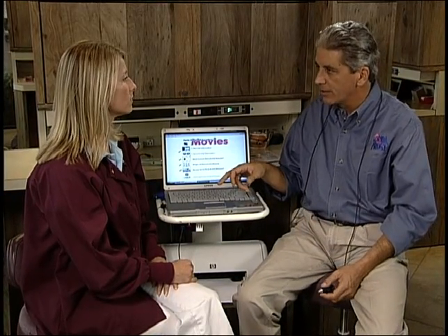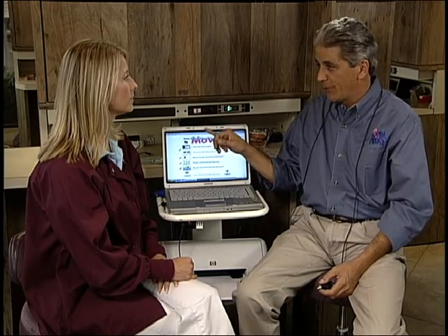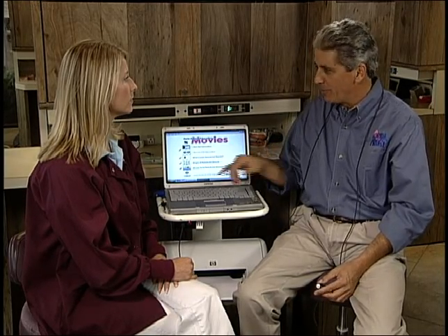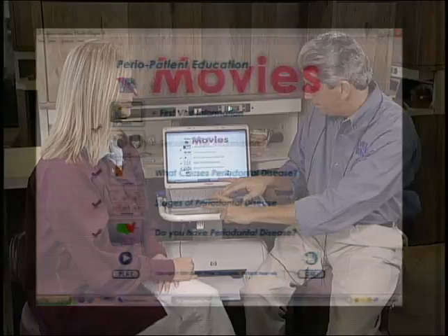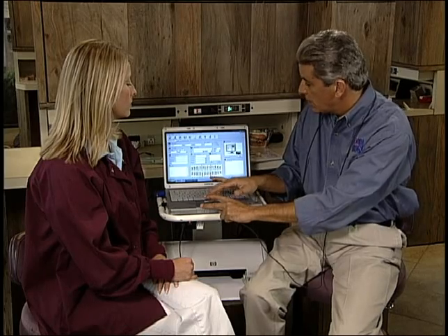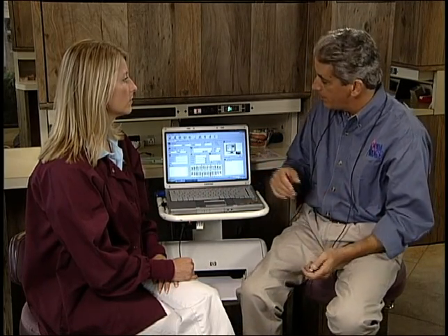If I click on play, I'm going to get all those items that are checked. So if you need three or four minutes to leave the room, you hit play and those are going to run for you. But if you click on an individual icon, whether it is checked or not, you're just going to get that one movie. That's all preparation for getting started with the exam — now we're ready to conduct the periodontal exam.